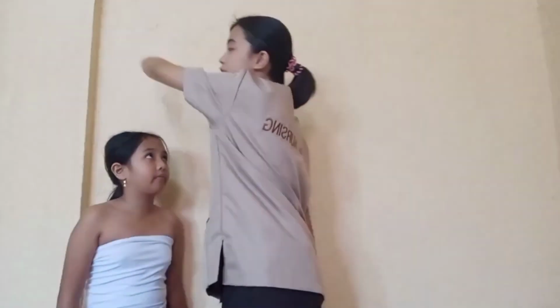So next, I'm going to put on gloves if appropriate or indicated and provide for my client's privacy. So assuming that I close the curtains and doors, after that I will select the appropriate site and the type of thermometer for the appropriate procedure. So the first thing is assessing oral temperature.